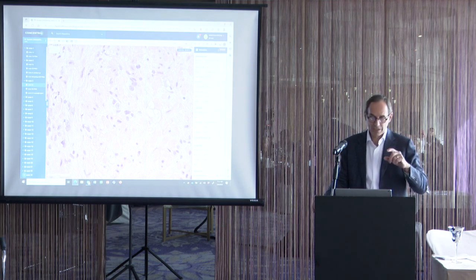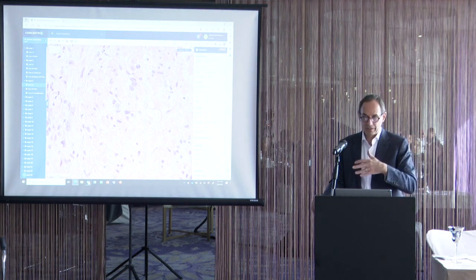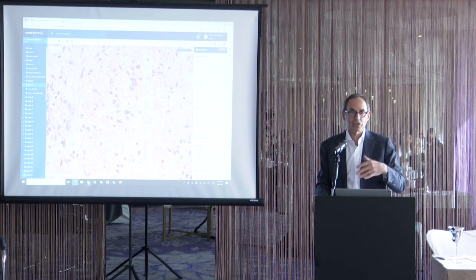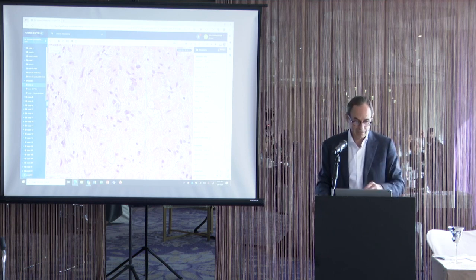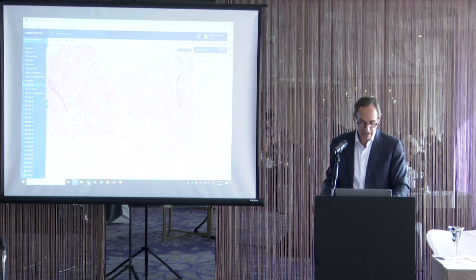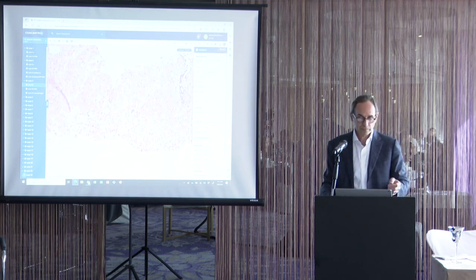With these patients, that means that the tumors responded well to the radiation. This patient is likely cured by the radiation. So to grade this as pattern 4, pattern 5, obviously would be entirely misleading. So in a case like this, we just say cancer with radiation effect and don't give it a grade.